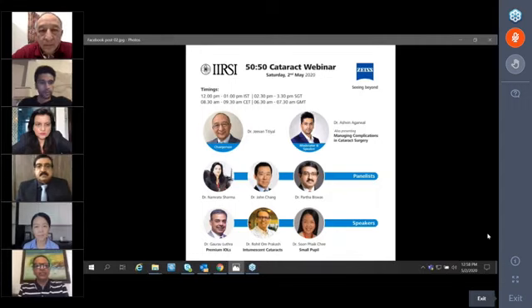Dr. Namrata and Dr. Jeevan, if you could answer, anybody: what are the other instruments out there for small pupil management? We've seen iris hooks and Malyugin ring in this scenario, but are there any other instruments and are they good enough? This is the question that has come.